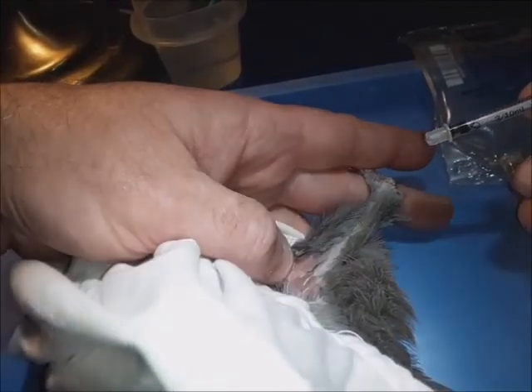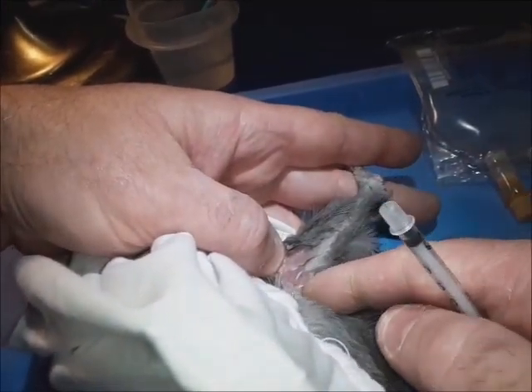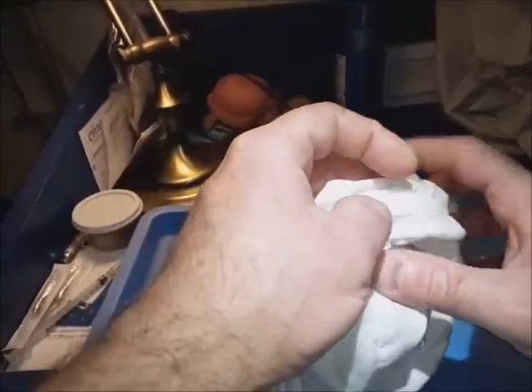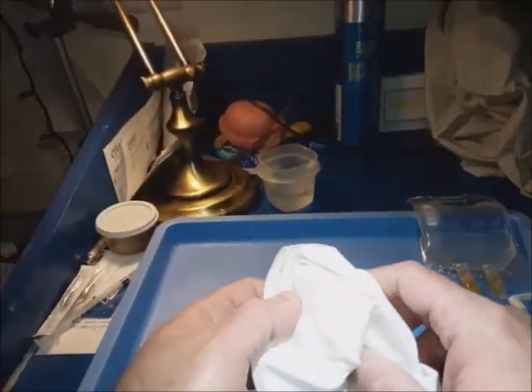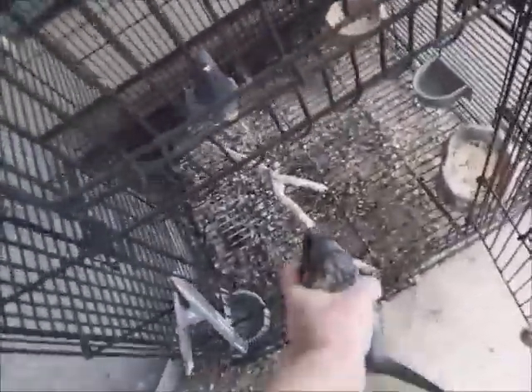When you pull the needle out, hopefully none of the medicine leaks out. Then we put the pigeon back in the cage with its friend.